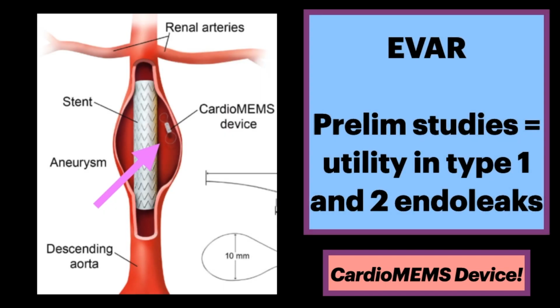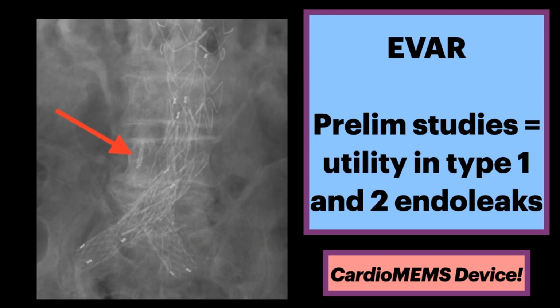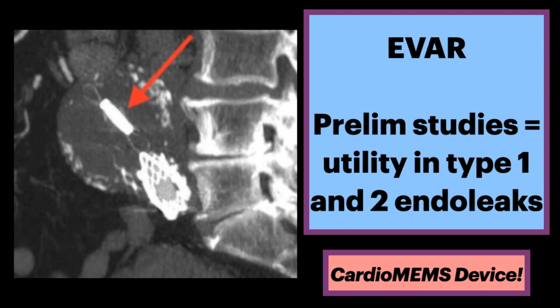While the CardioMEMS device is FDA approved for use in heart failure, studies have also shown the utility of hemodynamic monitoring in patients with aortic aneurysms after endovascular aortic repair, EVAR. This device is considered investigational with prior EVAR, but preliminary studies have demonstrated utility in early detection of type 1 and type 2 endoleaks. The imaging features of this device in patients with aortic aneurysms are similar to those in patients with heart failure. However, the sensor is inserted within the aneurysmal sac adjacent to the stent graft.